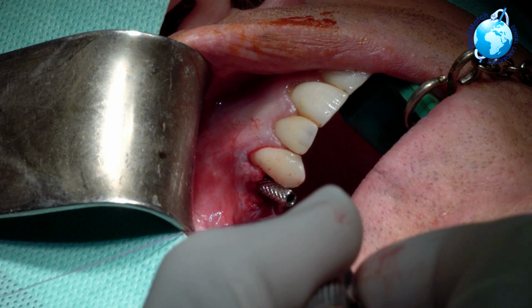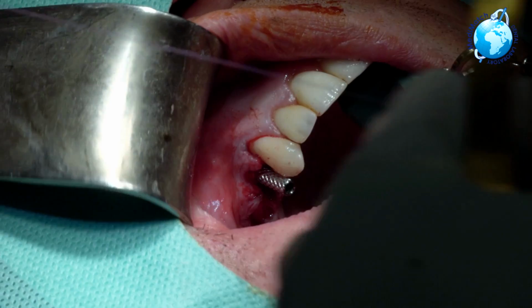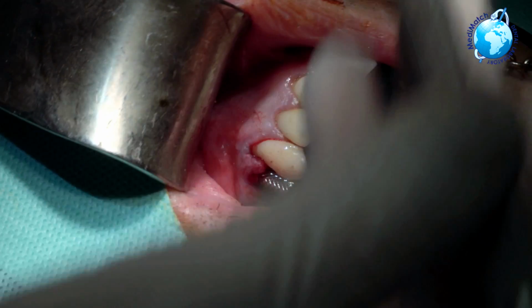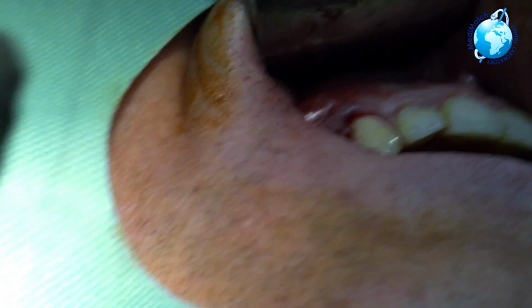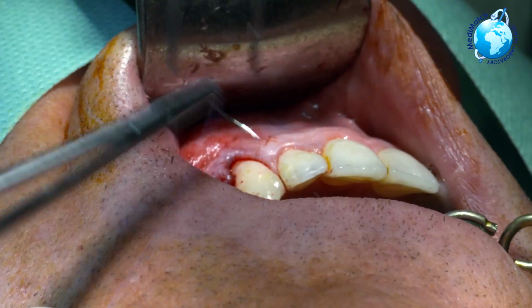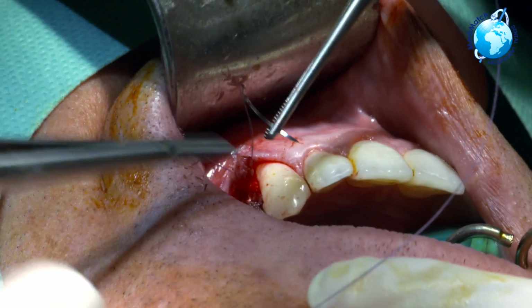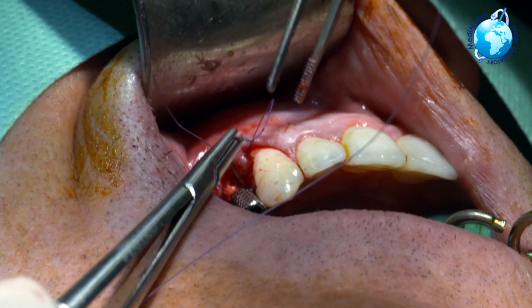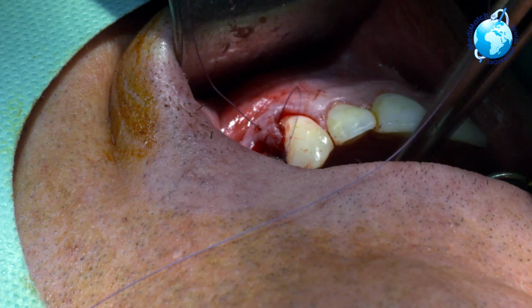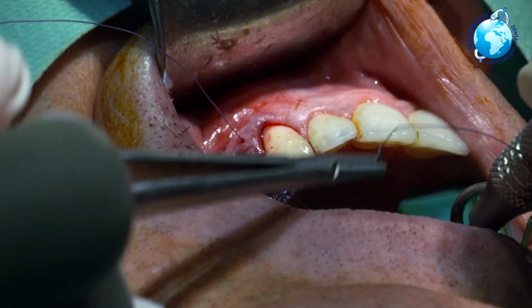There we go. So we're just going to set that stitch there. You're going to cut that for me. I'm going to probably set that now anteriorly on the papillae. You want to turn it towards you. Turn towards the anchor. Get my surgical light. So I just want to get that papillary form to face. I'm going to need a mirror because the camera's in the way. Thank you so much.